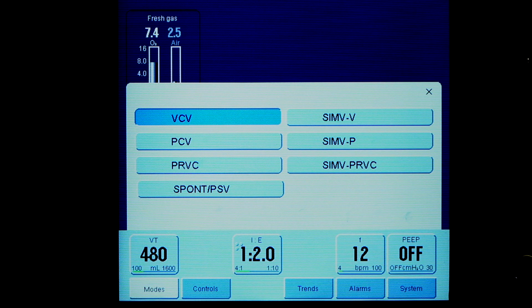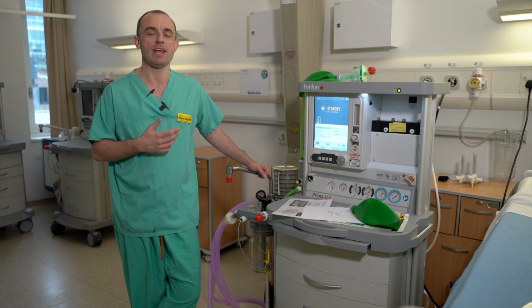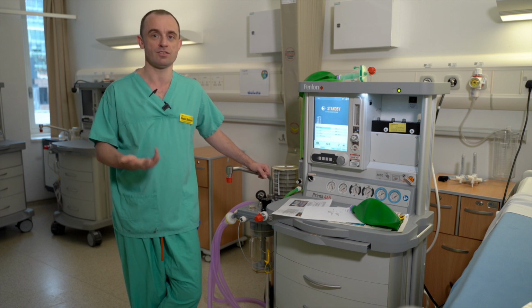So volume control, pressure regulated volume controlled, and then SPONT PSV, which we'd call pressure support. It also has a number of SIMV modes, which I'm going to talk through. But one thing that's most important about these top three, volume control and pressure regulated volume control, is that they are entirely mandatory. The Maquet ventilators, which you may be familiar with, if a patient tries to breathe over a mandatory breath or tries to breathe in a mandatory mode, the ventilator will sense that, and it will not try and ventilate someone who is trying to trigger.